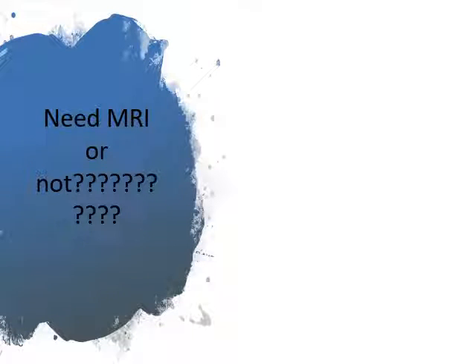So in the ER, do we need MRI or is the CT enough? By now, we know that the CT is very important in distinguishing ischemia from hemorrhage.